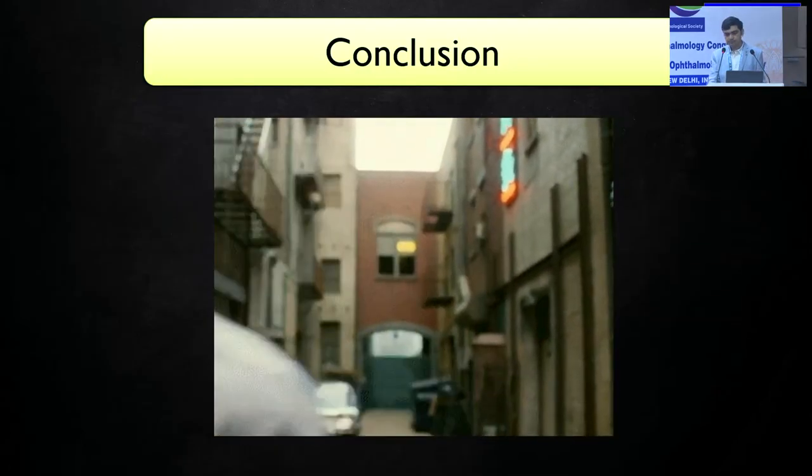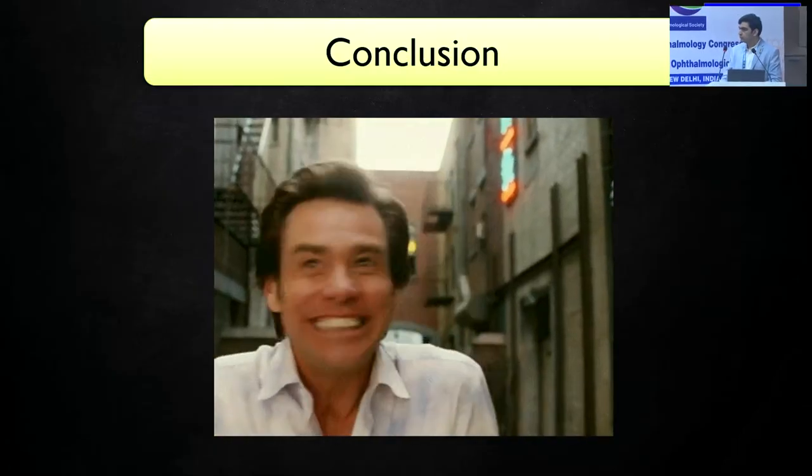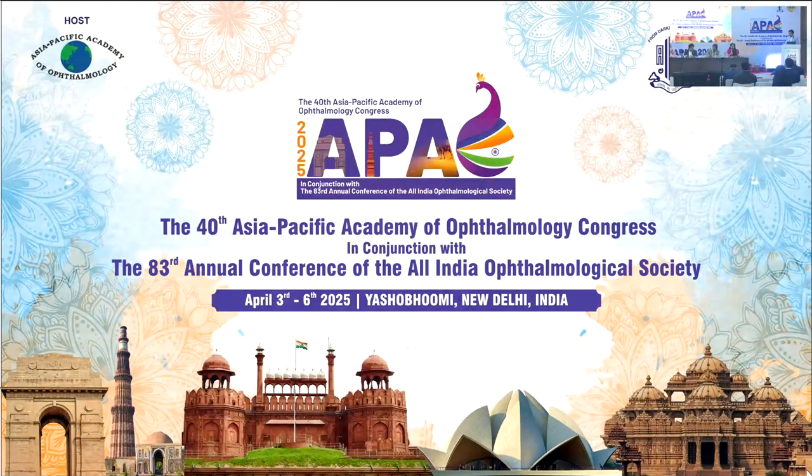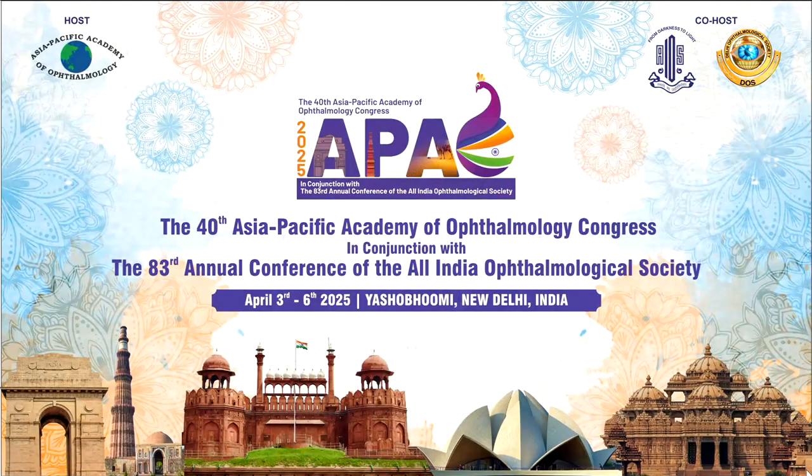Thank you. Actually, we still do one anterior and one posterior. I mean, we are amenable to anything. Did you see a distinct difference in all these eyes? Made you feel, no, I should be doing this step only and not the other one at all? Or would you feel, no, let me put this technique aside for those lenticules which are very thin, where the dissection may be difficult, where the OBL is dense, where this might be one easier step? It need not be done in routine.